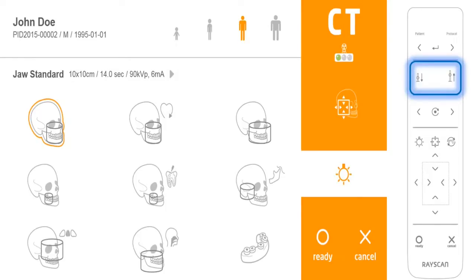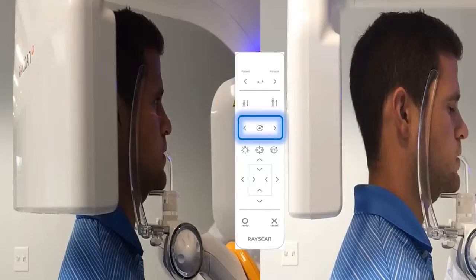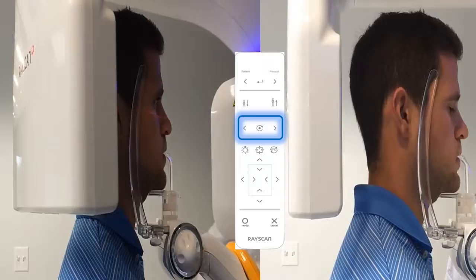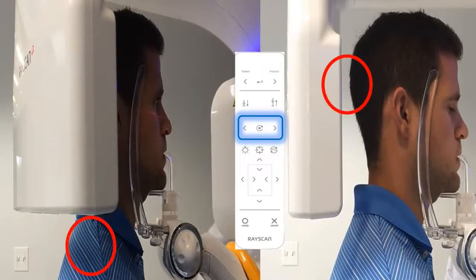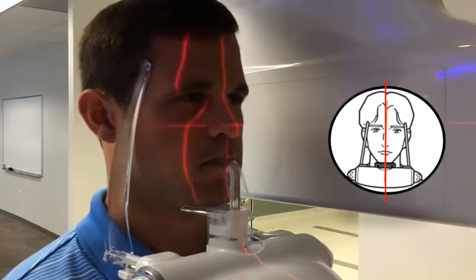Press the up and down buttons to adjust the height of the chin rest so that it is slightly higher than the patient's chin. Ask the patient to step into the unit and grab the hand grips. Ask the patient to rest their chin on the chin rest, then have the patient take a couple of steps forward to create a slight tilt of the spine.